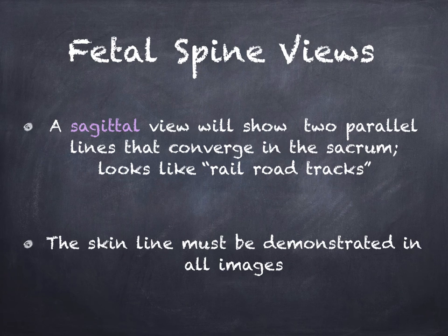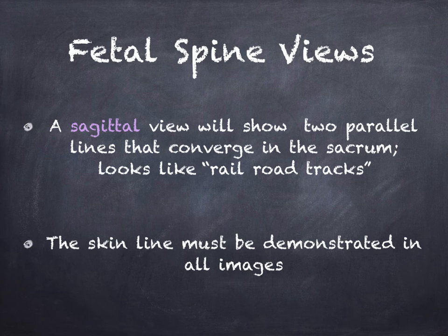In the sagittal view the spine will appear like two parallel lines that look a lot like a railroad track. Again, make sure you have that nice skin line.